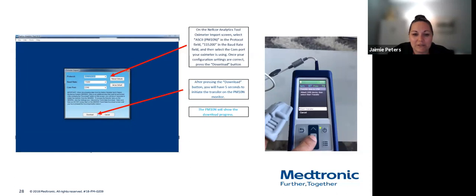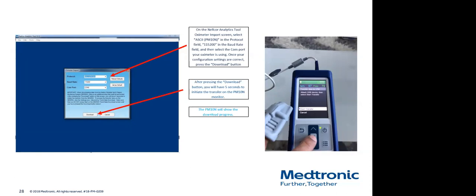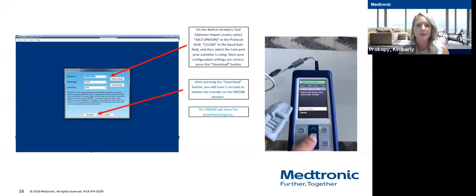Looks like Sheila has a question, or there are a few questions coming in. I'll let you read them. Okay, when doing oxygen testing, the 5-minute rest test, for example, with this machine, do we do this in continuous mode or use the spot checks? Does this mean we push the spot check every few seconds? Maybe I'll let you answer that one, Jamie.